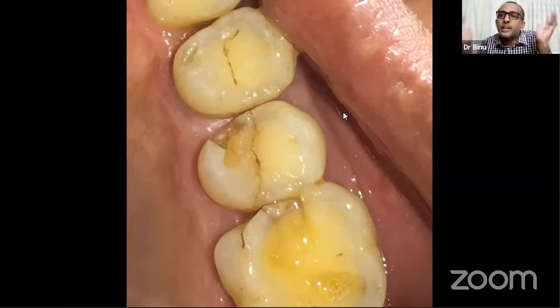It's a huge cavity. The patient has been walking around for the last 1 year with that cavity and says, had no pain, sir, I didn't come. So you know the diagnosis without even looking at the mouth. But will the patient understand what you're talking about? That's why, if the mouth mirror and probe are for you to see what is happening inside the mouth, an intraoral camera is for the patient to see what's happening inside the mouth. And if the patient does not see what's happening inside the mouth, your sale is not going to get closed.